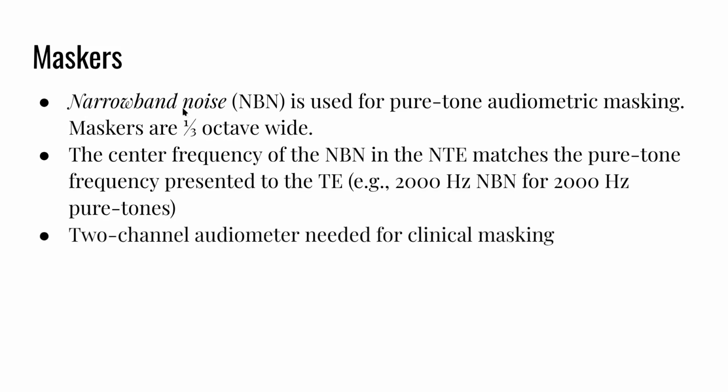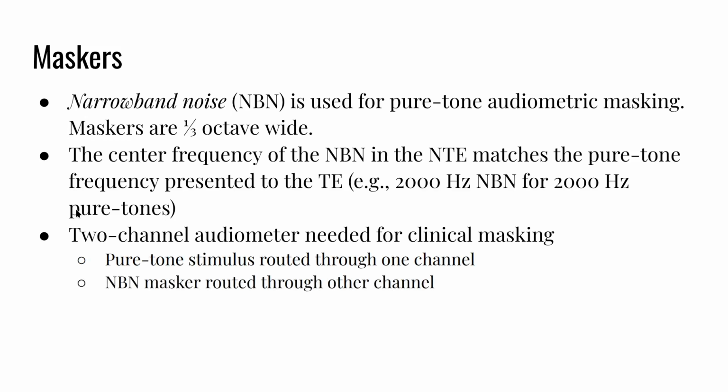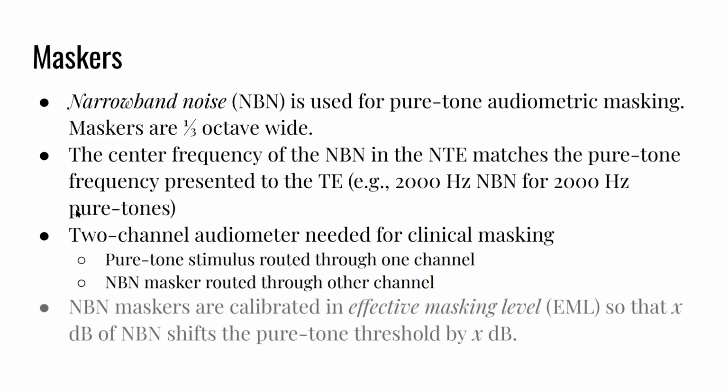You usually need a 2-channel audiometer. I say usually because you can have a 1.5 channel audiometer and that will work. Pure tone stimulus is routed through one channel, narrowband noise through the other channel.